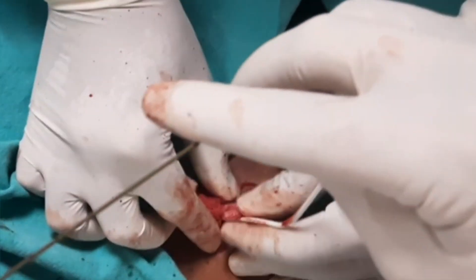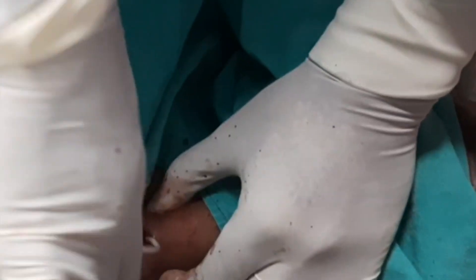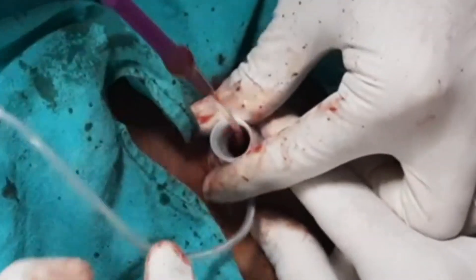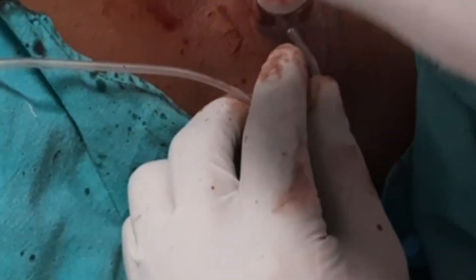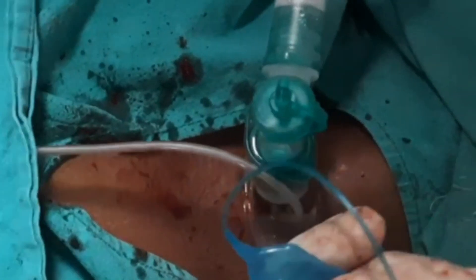Now we will insert our tracheostomy tube with the introducer. We have applied lignocaine jelly on the tracheostomy tube. We have to rotate and insert it. After inserting, we have to remove everything inside including the introducer. A little blood can come — no problem.